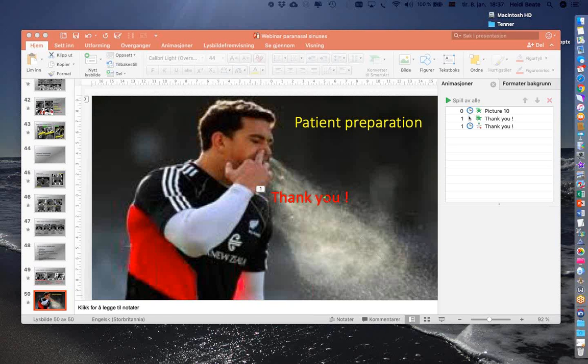Okay, so we have a question from Dr. Hiremat. Is there any specific level on coronal images to measure the depth of the olfactory fossa in the Keros classification? Thank you for the question. I think you should just use the coronal image with the deepest olfactory fossa. And it's usually very close to the level of the osteomeatal complex.